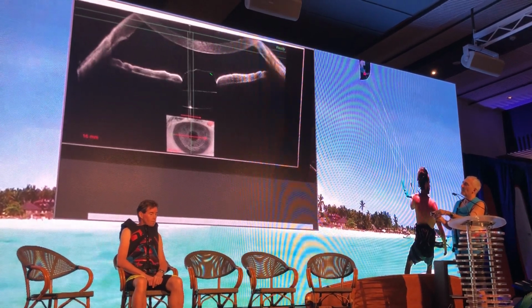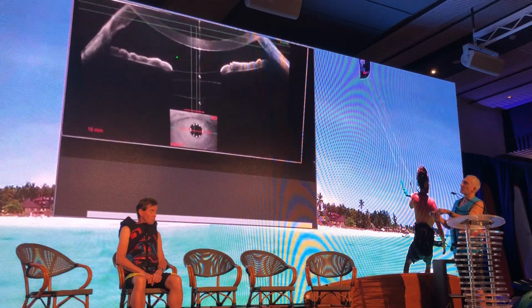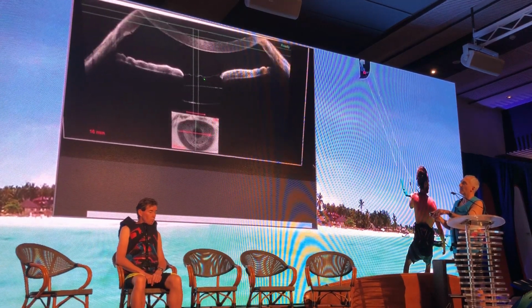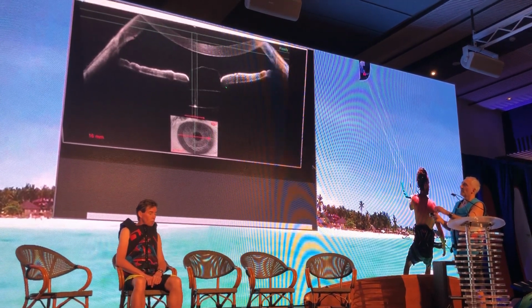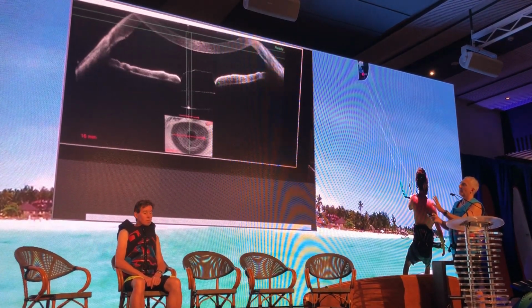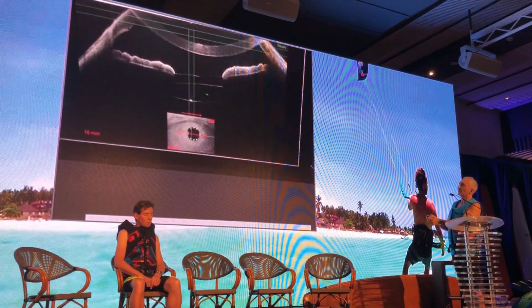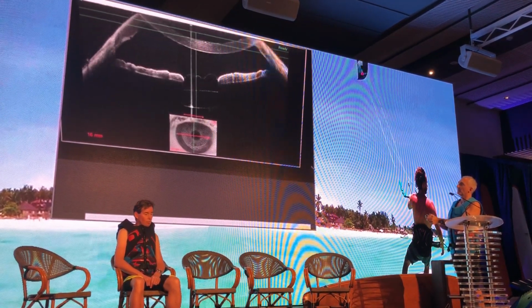This was actually taken with my phone. The video was not yet there 2 years ago. This is a fibrin membrane in the pupil that I found the day after a cataract surgery. It disappeared the next day with therapy. It's beautiful because using a placido disc, switching on the light, you get the pupil constricting and you see what happens to the fibrin membrane. And this is, of course, the IOL standing behind with the vitreous.